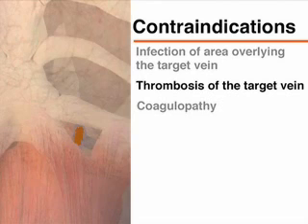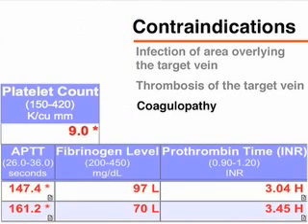Site-specific and relative contraindications include coagulopathy. Although this is not an absolute contraindication, extreme care must be exercised in patients with coagulopathy and in other patients for whom complications would be life-threatening.